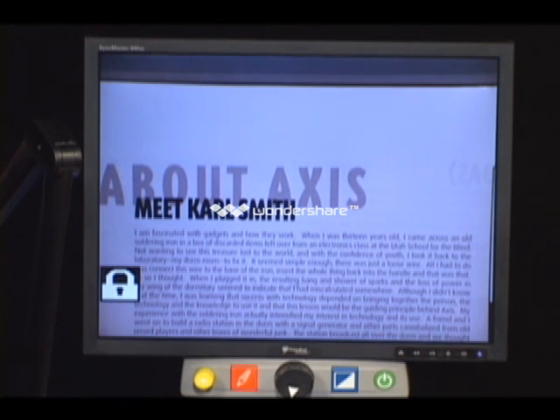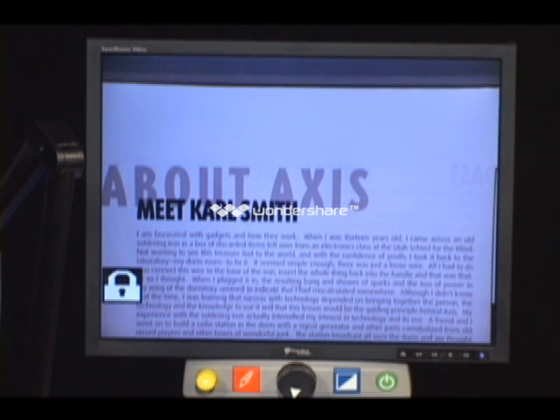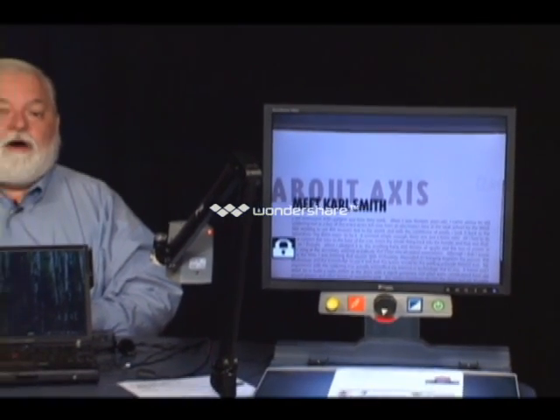I had one customer, for example, once who liked to collect and look at rocks, different kinds of rocks. And we found that if you put the rock under there, get it focused the way you want it, and then turn off the autofocus, then you could move the rock around some and keep it basically at the same distance, and it would pretty much stay focused the way you wanted.